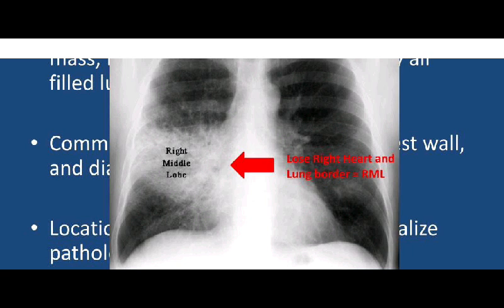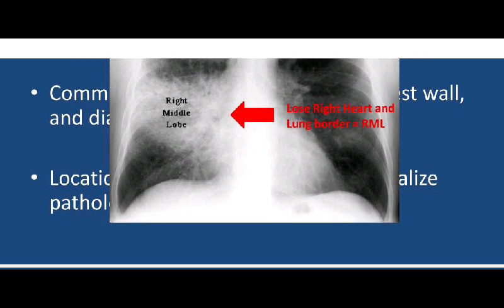Now this is a serious sign because it's trying to tell you that normally this thing is not meant to be here, but now it has actually appeared there, and it's telling you that this is not normal. So in my own instance as a radiographer, what will enter my head as of now is that I'm suspecting a mass already, before I start looking well for that. It can also be an infiltrate. It's also looking like an infiltrate, but for now it's a mass. Then when I start narrowing down, I can actually get an accurate pathology for this chest.